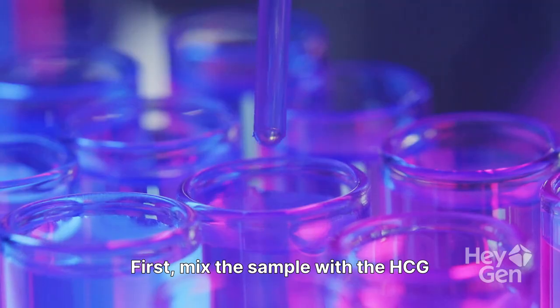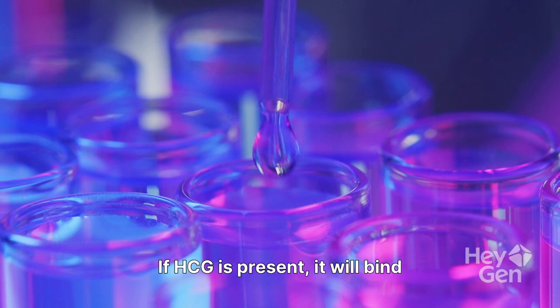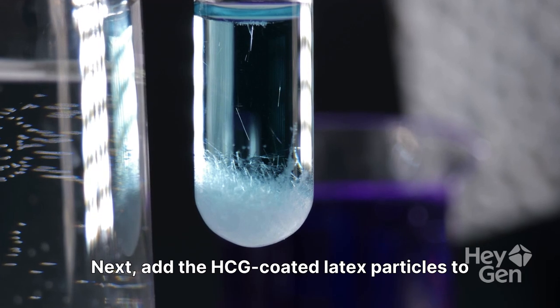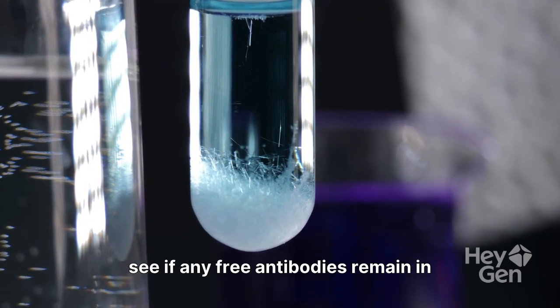First, mix the sample with the HCG antiserum. If HCG is present, it will bind to these antibodies. Next, add the HCG-coated latex particles to see if any free antibodies remain in the solution.